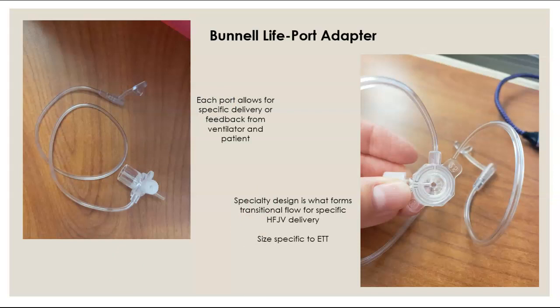I know troubleshooting's later, but sometimes if you're just having issues, maybe you're getting weird feedback numbers and nothing's changed. I've just switched out my life port adapter before. A big thing is sometimes humidity gets in here for your feedback, and that can cause some complications. They're one of the cheaper parts of this expensive ventilator, so it's appropriate to switch them out if you've had a baby on the jet for a while and you're just suddenly getting weird numbers.